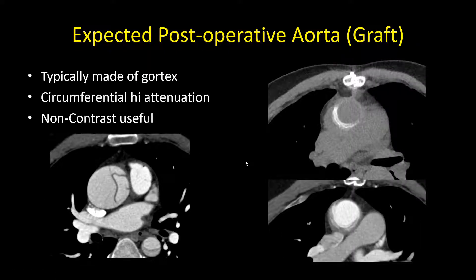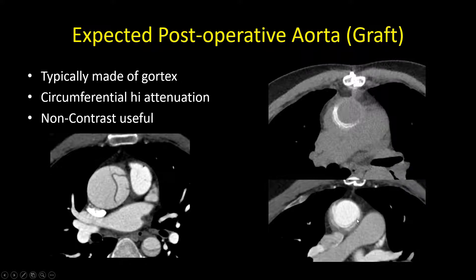Moving on from the pledget, another normal post-operative finding is the graft itself. Typically made of Gore-Tex, it will be circumferential — 360 degrees around the aorta. On non-contrast examinations, don't confuse this for an intramural hematoma. It will be very well demarcated, smooth, and high in attenuation, with interspersed low attenuation from the wrap itself. On the post-contrast study it will look very symmetrical and well demarcated, unlike an intramural hematoma. This is what it looks like in a patient who had a type A aortic dissection repaired — the high attenuation Gore-Tex graft on non-contrast and its appearance on post-contrast.